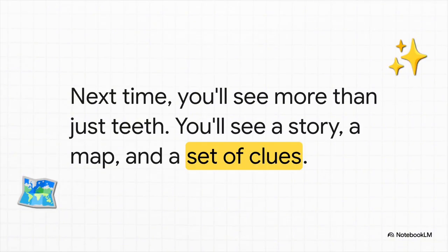So the next time you're sitting in that dentist chair and an X-ray pops up on the screen, you won't just see a jumble of teeth anymore. You'll see a story, you'll see a map, and you'll see a set of clues. And now, you'll actually know how to start reading it.